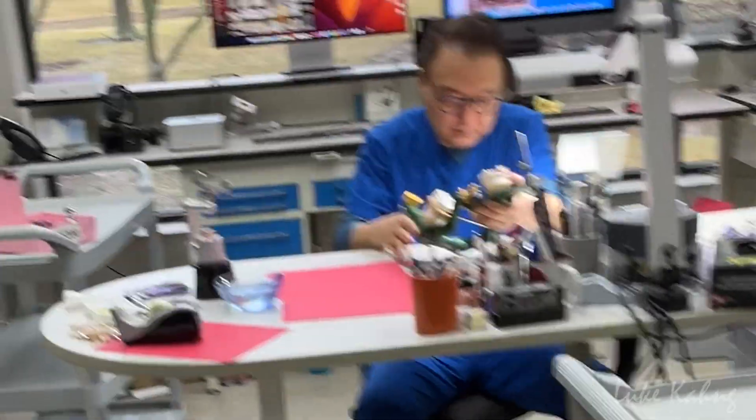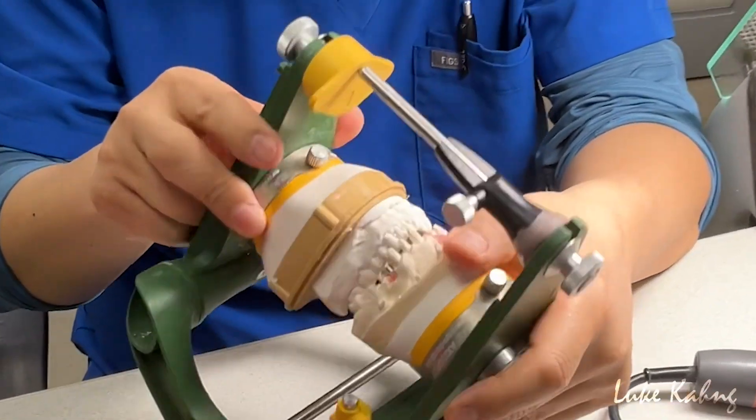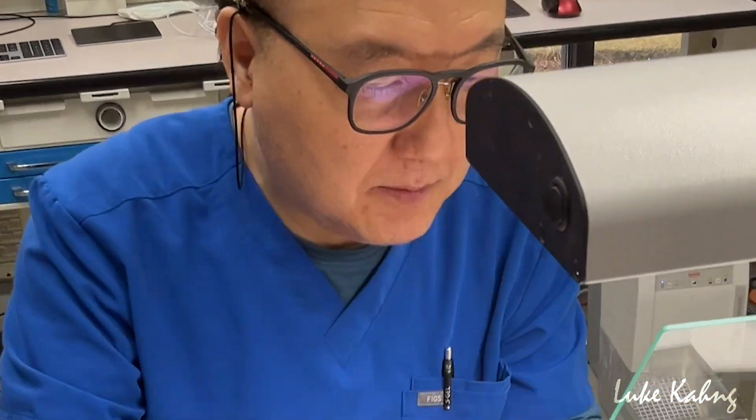It's Monday morning. Luke has a big combination case that he's working on and evaluating, so let's see what he's doing. Here's the full mouth case — the bamboo.